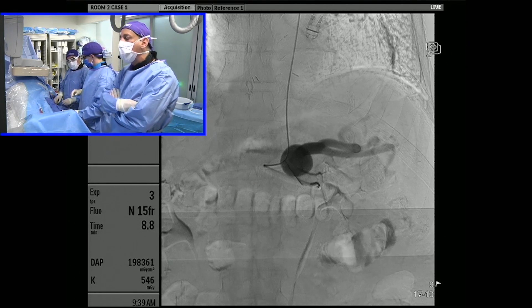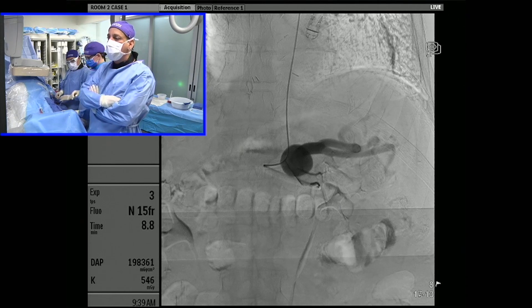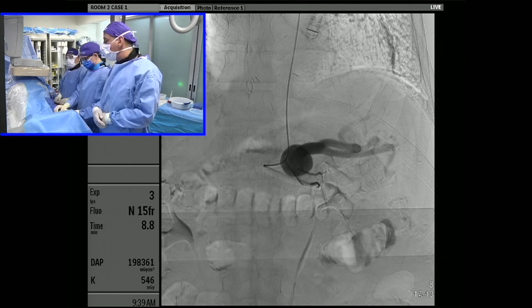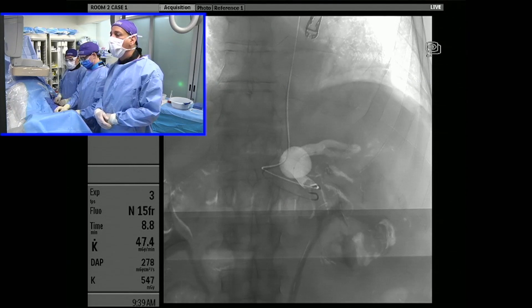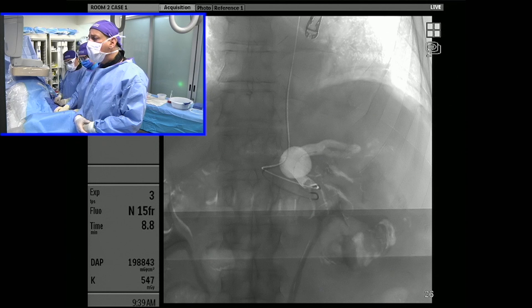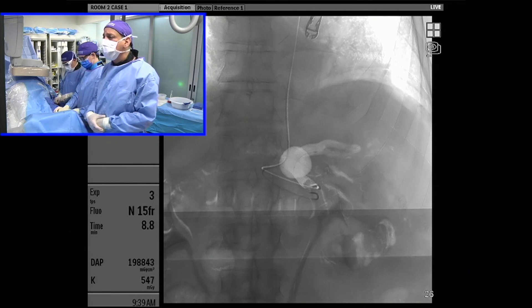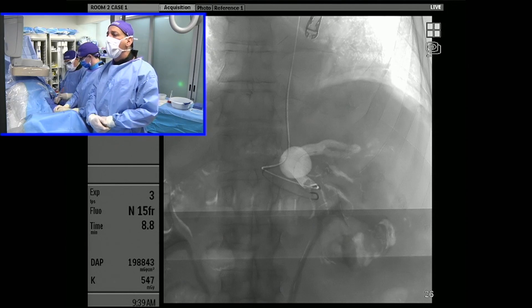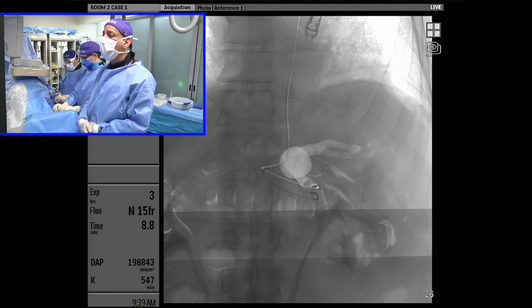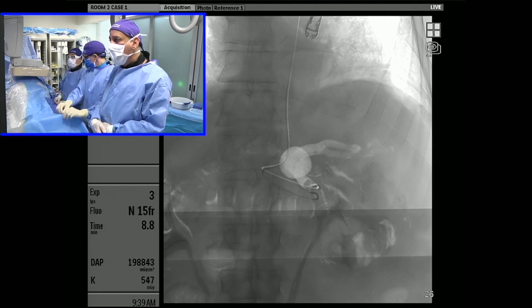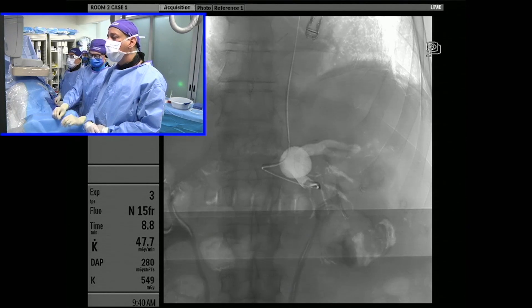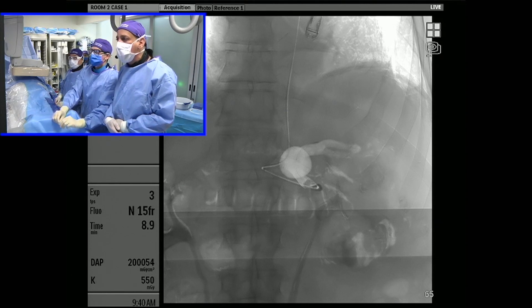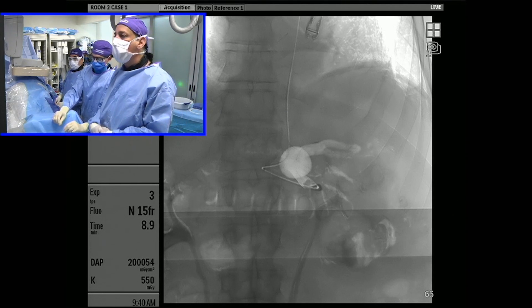We're going to coil the outflow, come back and coil the aneurysm itself, and then coil the inflow. Hopefully we'll be done in about 20 minutes. We have an 018 detachable coil we're about to introduce into the outflow vessel. We have a 021 microcatheter which is 150 centimeters long — obviously necessary when doing these cases from a radial approach. It's exposed past the 035 catheter by about 10 to 15 centimeters, as you can see here.